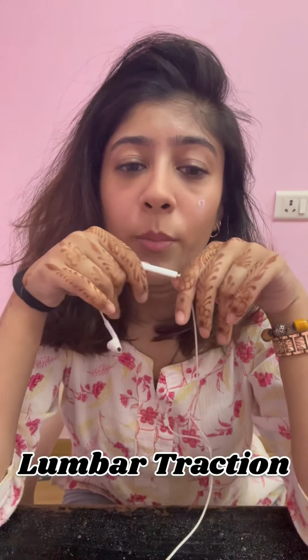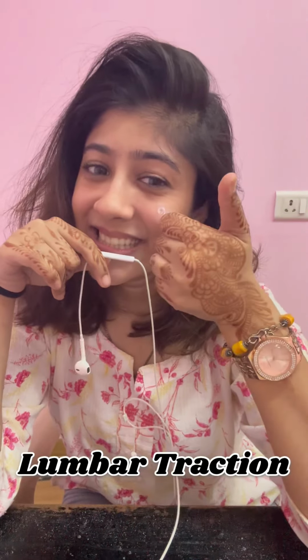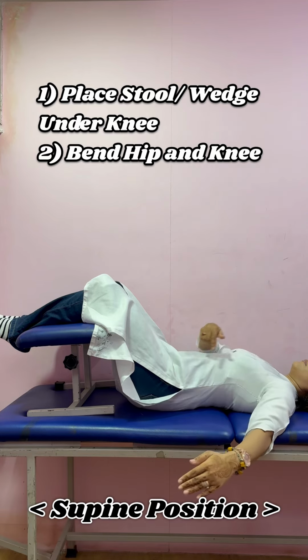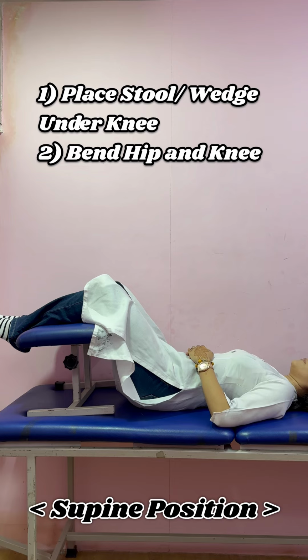And today we are going to talk all about lumbar traction and how you give it to patients. First one being supine, which is the most commonly used position, where there's a stool placed under the knee and the hip and knee are bent at 90-90 each. It is good because it reduces lumbar lordosis and increases the traction force on the intervertebral disc.